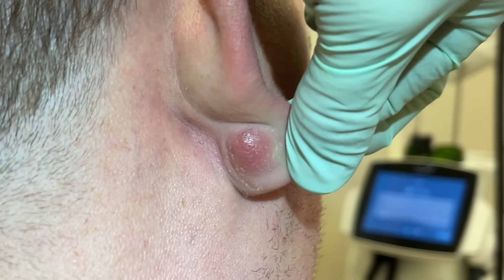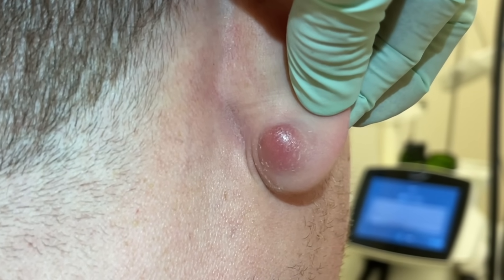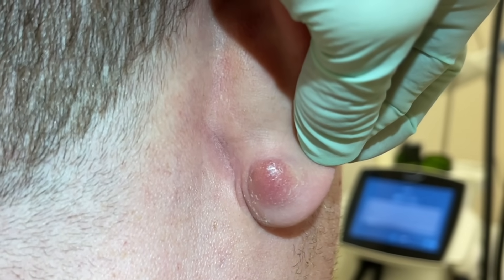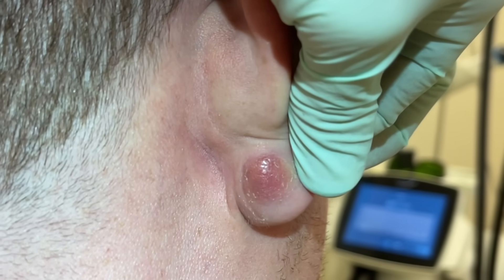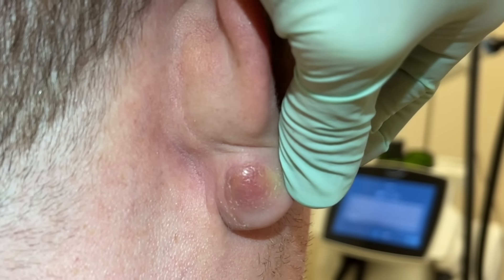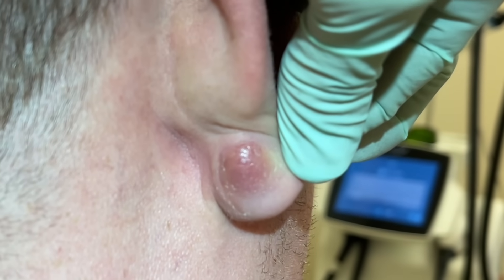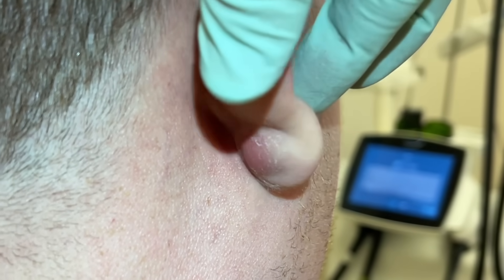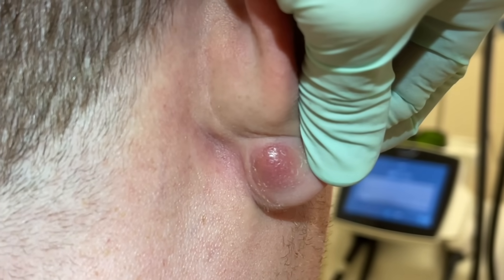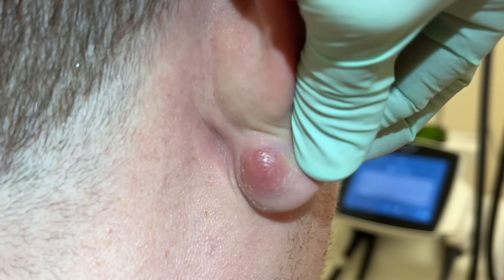So it's turned into like a small abscess or an inflamed cyst. What we're going to do is numb up that whole earlobe and then make a little cut there, get that fluid out. We should be able to get the sac because this is a small area — just a couple weeks ago that sac was about the size of a dime, so it's a decent sized cyst. It just may have burst. We may do some stitches on this one because it's pretty newly getting inflamed. There may be a little bit of pus but if we can get that whole sac out we'll just close it up.